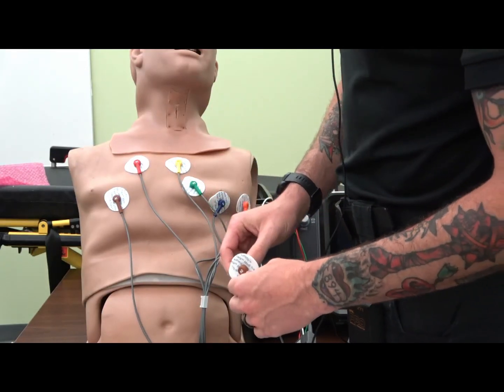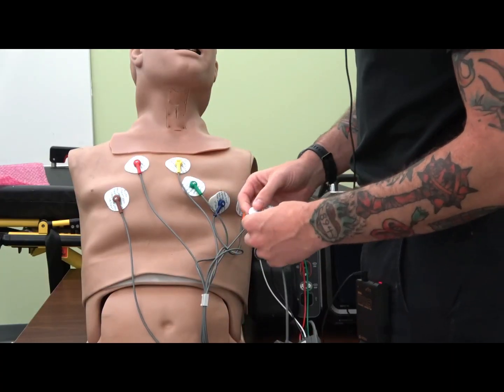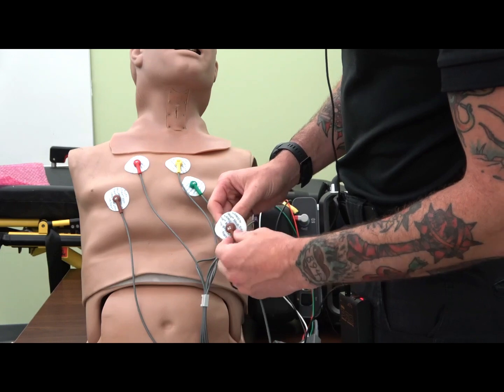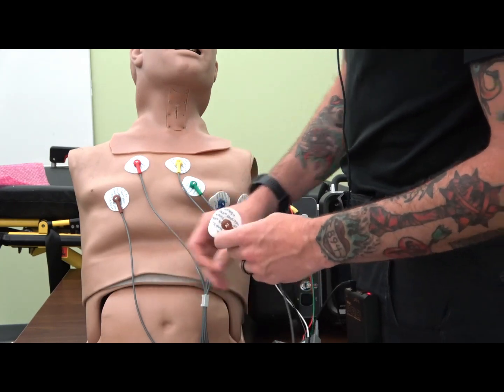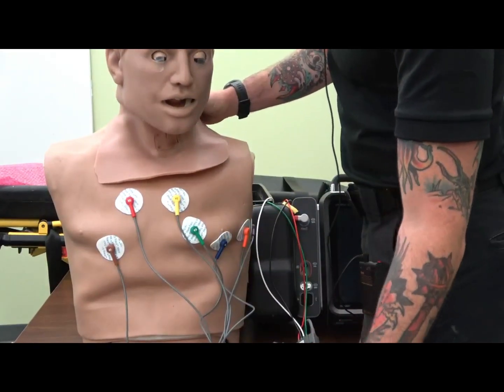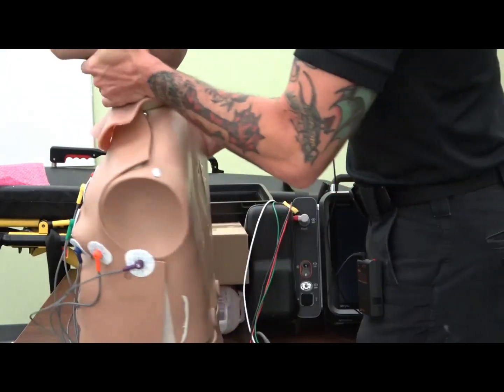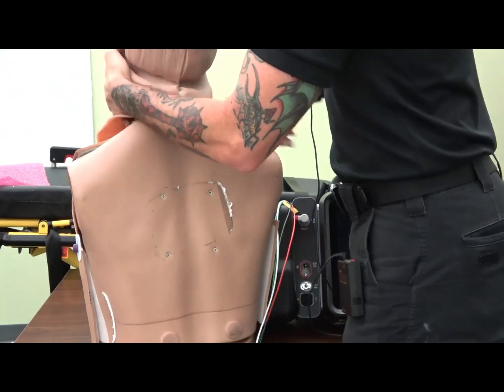And V8 is going to be on the same plane as V4, 5, and 6, although it is going to be the mid-scapular line on the left side of the patient. So I'm just going to move this patient around so that you guys can see.